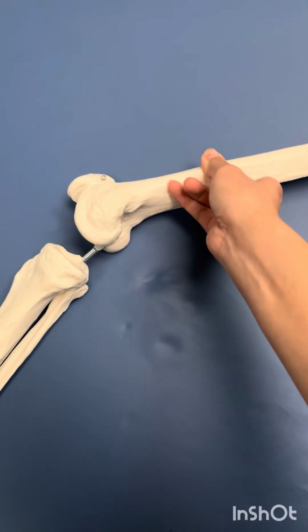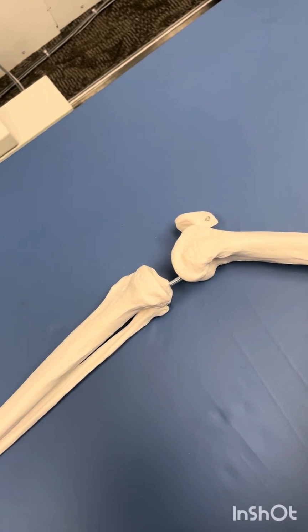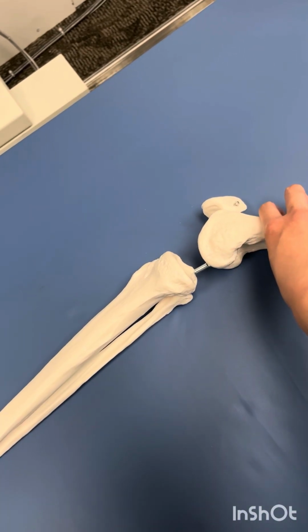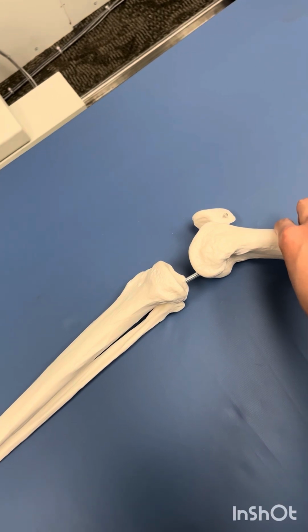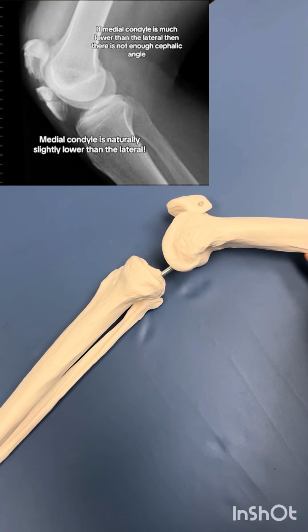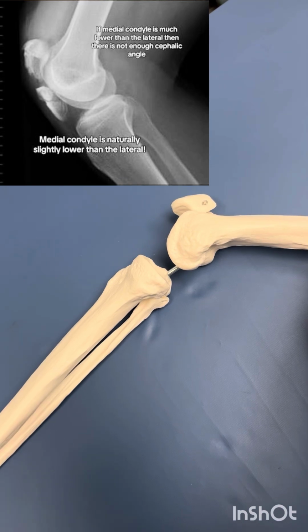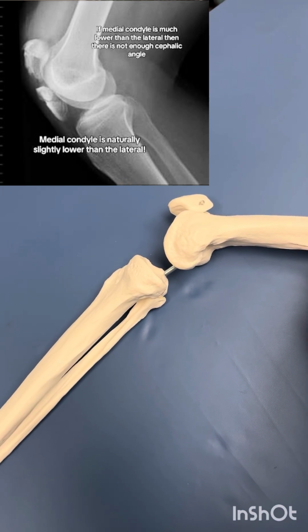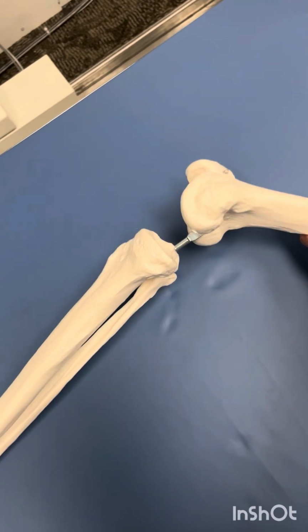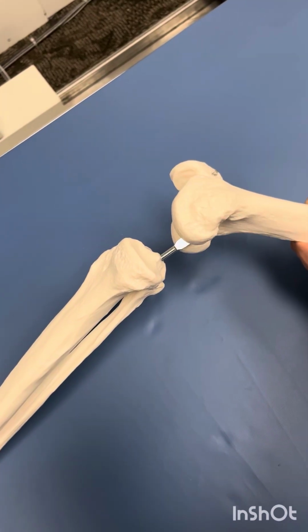When you do a lateral knee, normally the reason why for a lateral you have to add that 5 to 7 degree angle is because the medial condyle is just naturally lower. Adding that 5 to 7 degree cephalad angle will make it superimposed. If you take the picture and add the angle and the medial condyle is still lower than the lateral condyle, that just means that you have to add a more cephalad angle. And if the lateral condyle is lower than the medial condyle, you would have to do a more caudal angle.